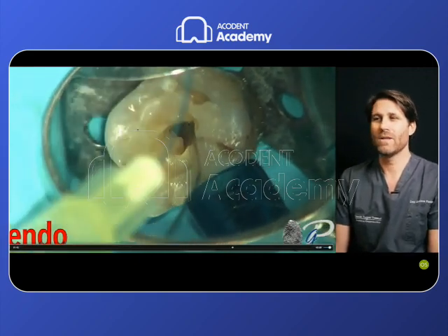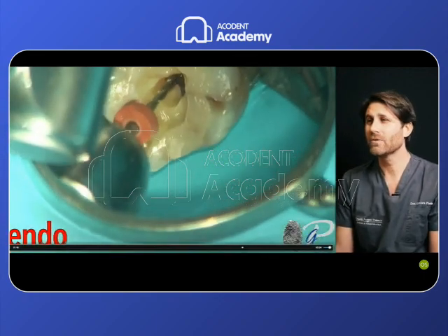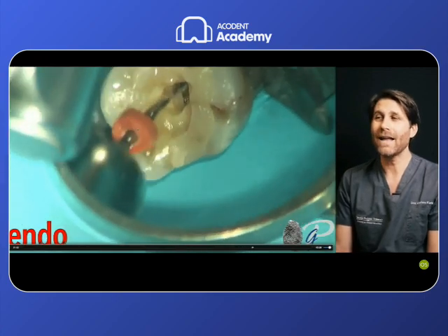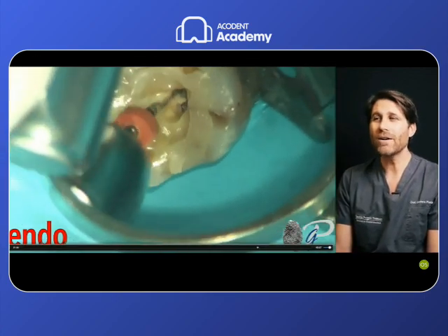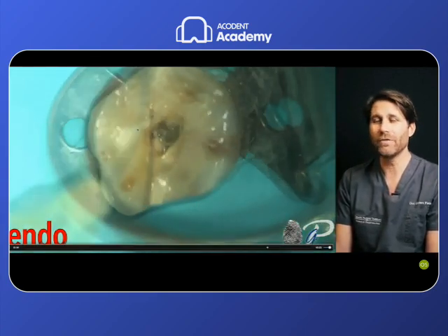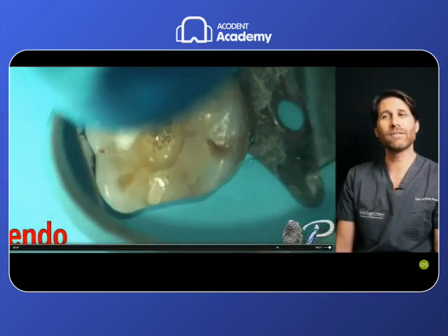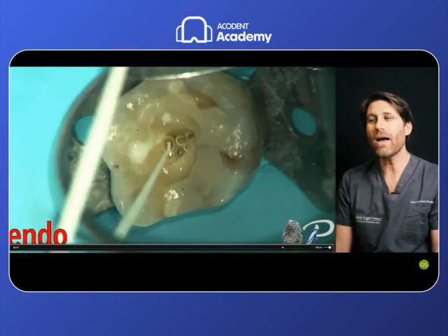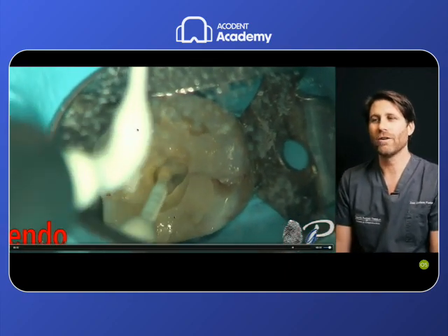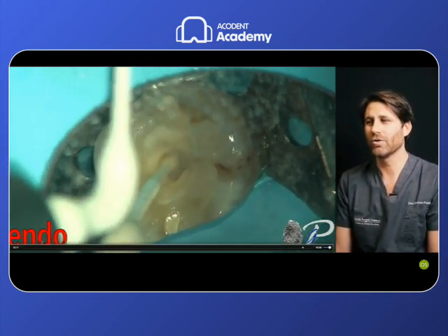So as you can see, the instrument is used with 3 to 5 pecking motions, advancing more or less 1 millimeter each motion, and then after each peck, irrigation. We can perform a brushing action to selectively remove the interferences with the use of this file, because this file has very good cutting efficiency, very good lateral cutting ability. So during brushing, when we go outside from the root canal, we can remove the coronal interferences to prepare the pre-flaring for the root canal preparation with the next file.